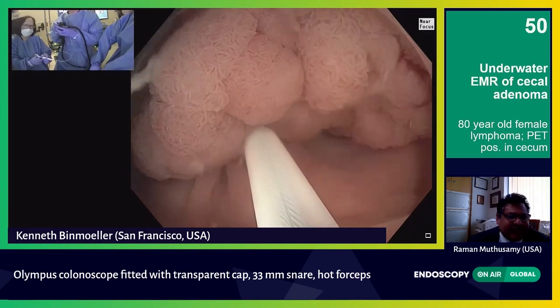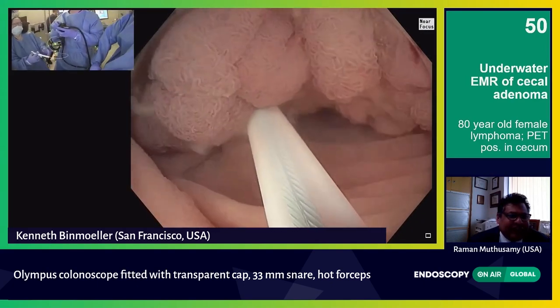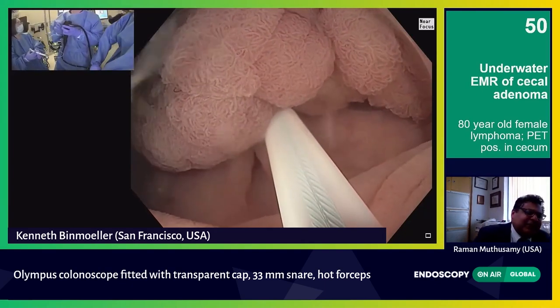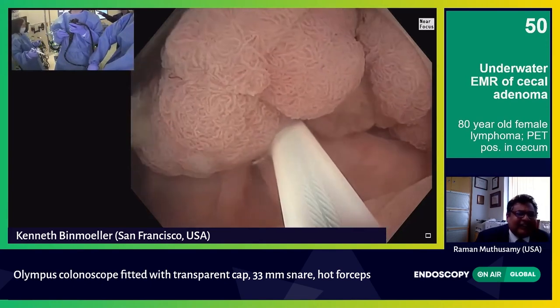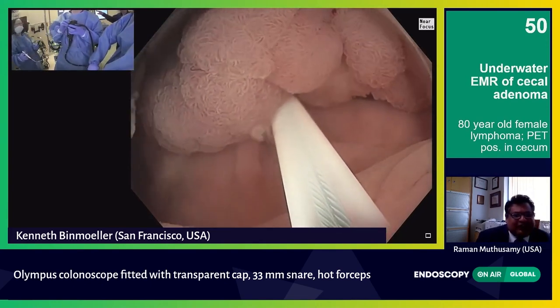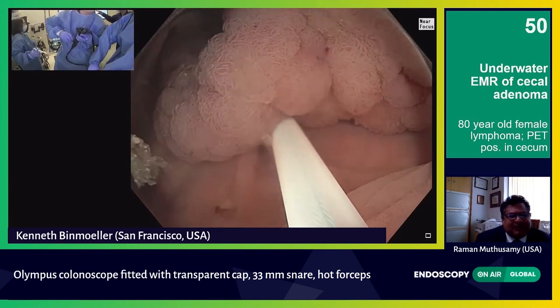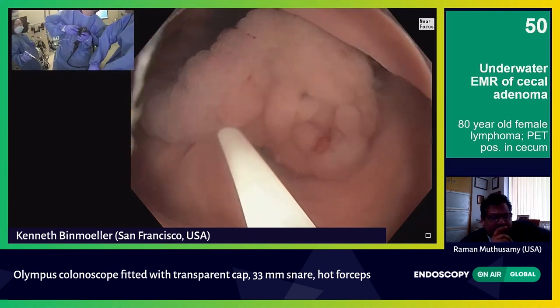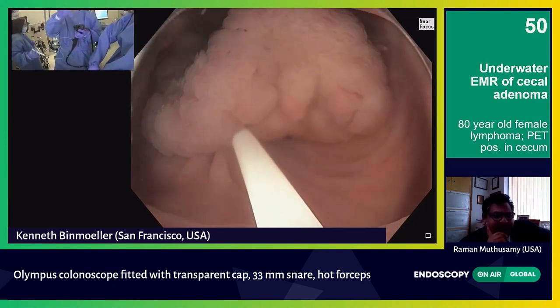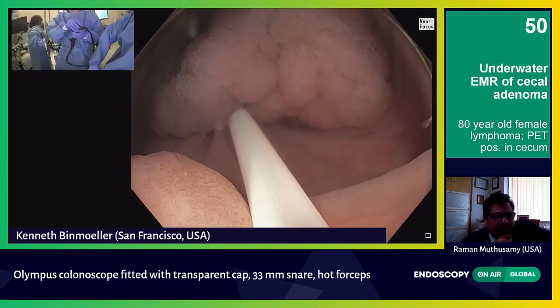Now I'm just swiveling. You can see the base is a lot smaller than the top. So now what I'm doing is pushing this snare out and just swiveling — like a rotisserie — to look. When I have dots, I'll look for those dots on the perimeter as well. In this case I didn't complete the dots, but otherwise I look for those dots to see whether I got them.